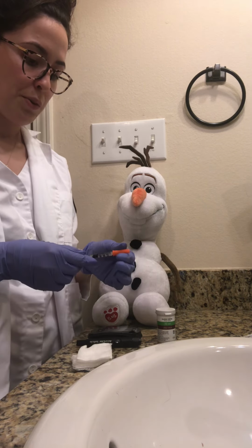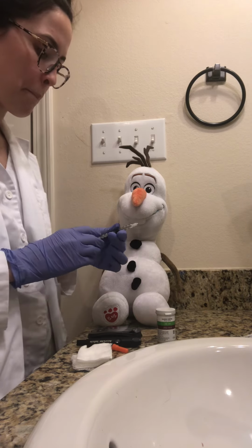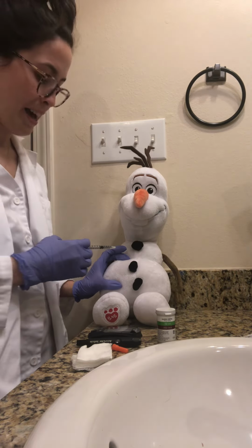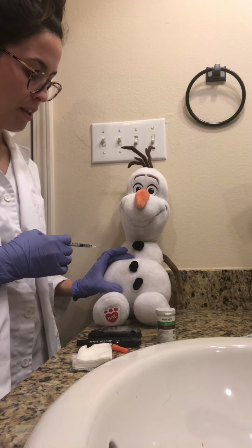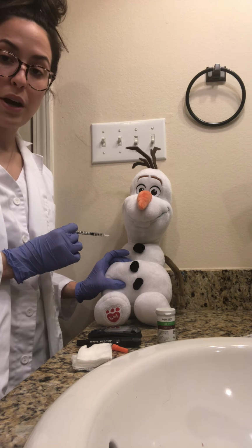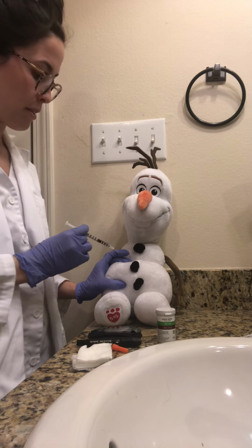I'm going to take off the insulin cap, and then I'm going to pinch around the area that I had wiped with the alcohol swab, and then I'm going to pinch like this, and we're going to let him know when we're going to stick, and we're going to administer the medication slowly.